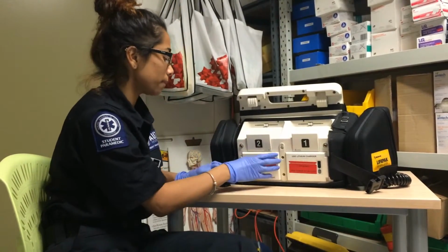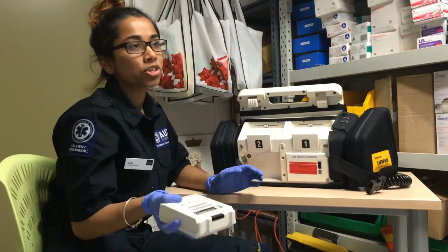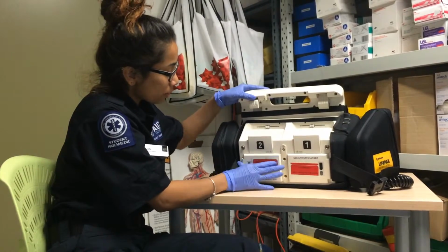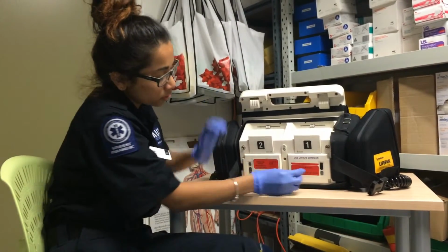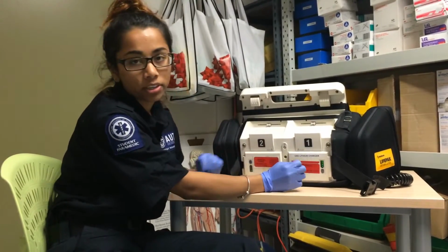And if they are flat, you can just remove them like so, put them on charge, and once they are charged, then you can place them back into the machine. But just remember, when you do place them back on, you want to click the grey button once again to check if they are in fact charged.